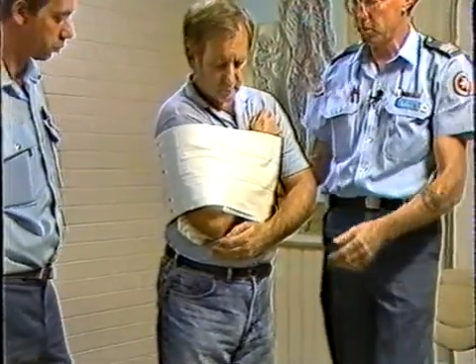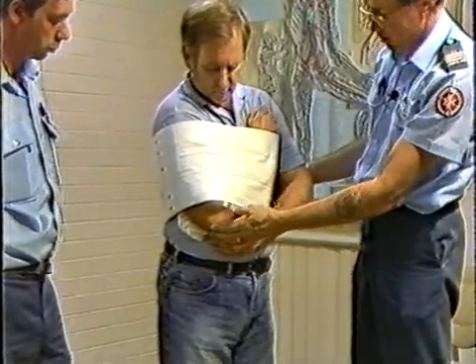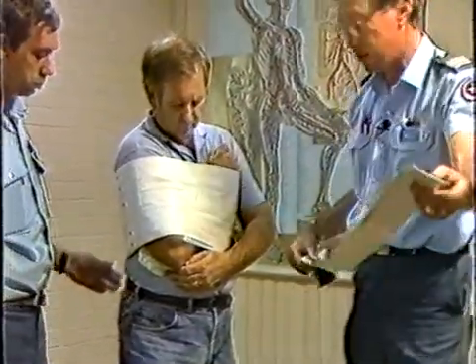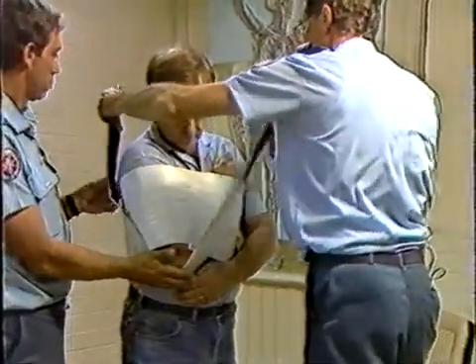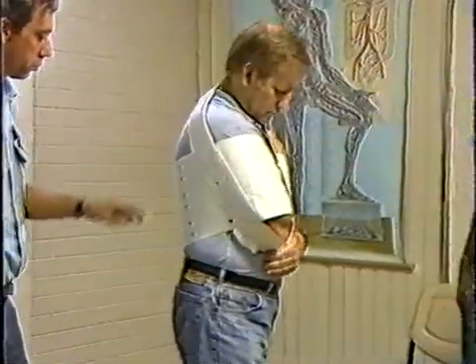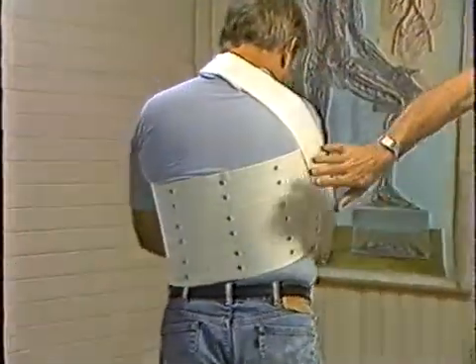If we wish to, and the patient feels that there's not enough support, or we feel we want extra support, simply done, just the long narrow one under the elbow, and that's it. So if we get the patient to slowly turn around, we can now see that we've got uniform support.